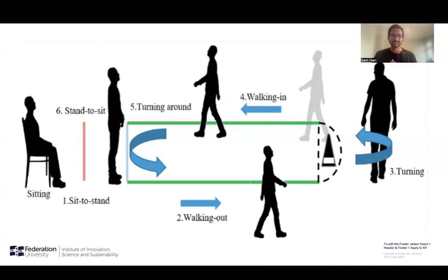So for the proposed sensor, I trained an Arduino RP2040 Nano microcontroller with the six phases of the TUG test, and I input data from the gyroscope and accelerometer. I labeled the data, so the microcontroller can understand if it's standing, walking, or turning. I also created a k-means anomaly detection learning block, which can see if there are any outliers from the normal walking patterns of a human. When there are outliers, it predicts there's a risk of falling in the individual.